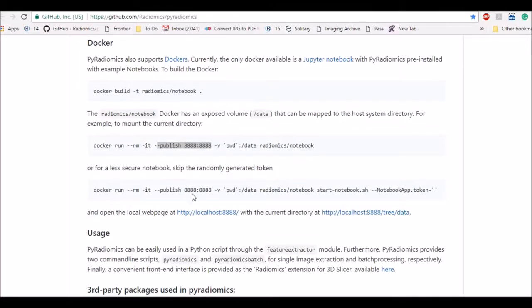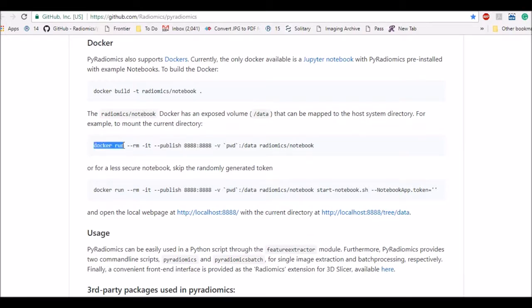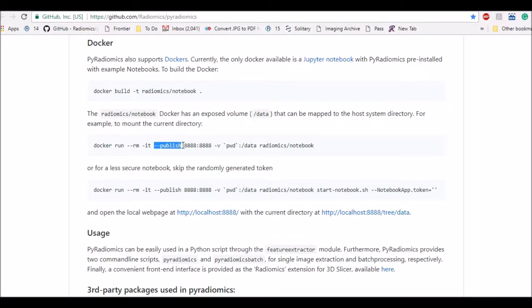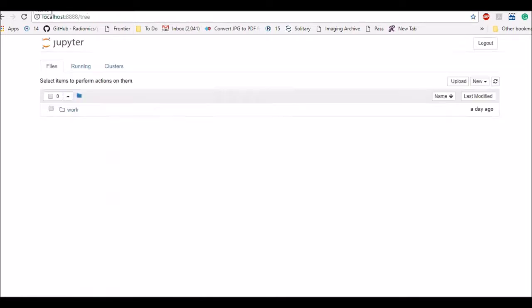So when you run the docker command it will produce and publish a page on your root port 8888. The way it works is you specify docker run command and you are asking it to run radiomics notebook package. And the volume which is going to use dash v is going to be picked up from your data directory and the results will be published on your local root port 8888. So once you run this command docker will give you specific web address which you can cut and paste with token on your local browser. So I use chrome and once I run this it creates a tree on root port 8888.